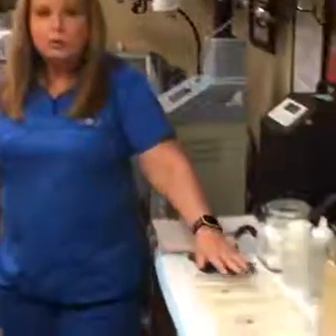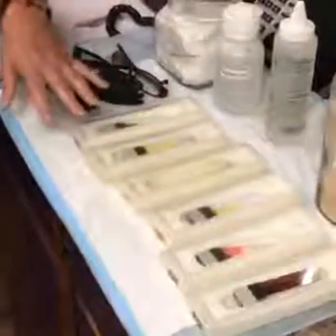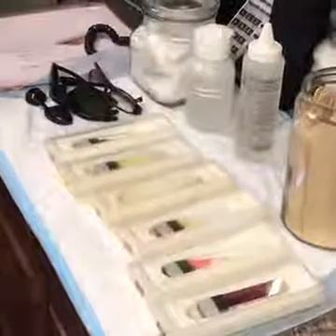We have numerous filters that we use per treatment. Each one serves a different purpose. One is for treatment of vascular, so for like facial veins. We also use one for hair reduction, acne, and also one for pigmented lesions, so for dark hyperpigmentation that we may get actually even from just sun tanning and all throughout the summertime.